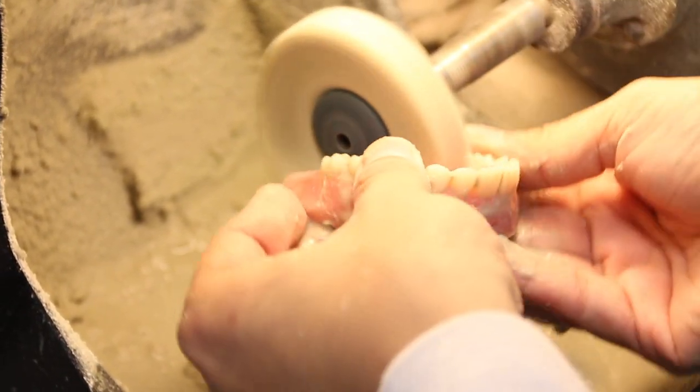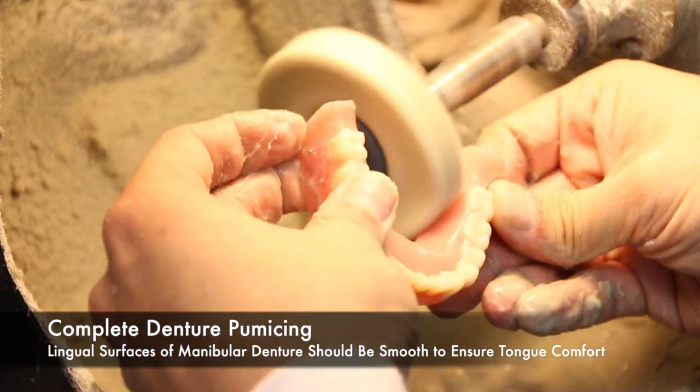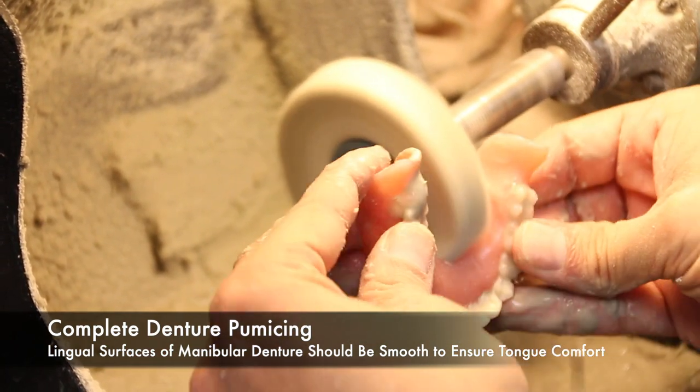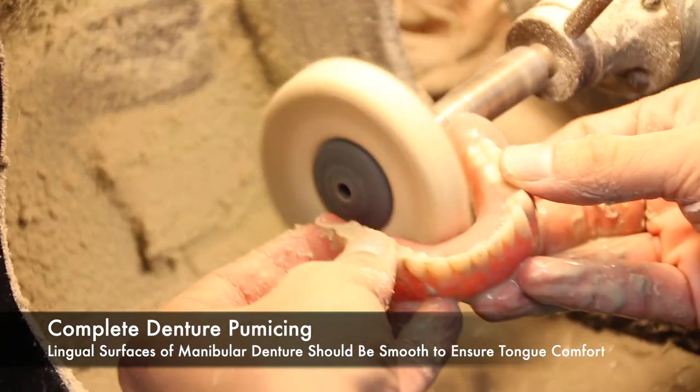Now there are some surfaces within complete dentures that we would prefer to be smooth. One of them being the lingual surface of the mandibular denture, because roughness can be distracting to the tongue. So the smoother the lingual surface of the mandibular denture, the better.